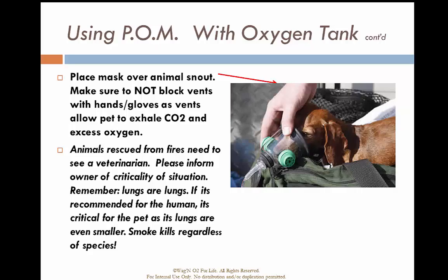Make sure you have a good rubber seal around the snout, and do not block the green exhalation ports on the side of the mask, as this is how the animal will expel CO2 from the mask itself.